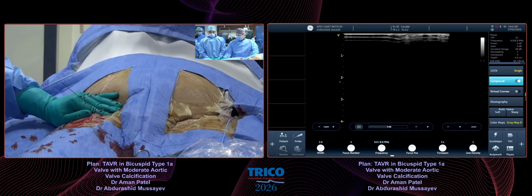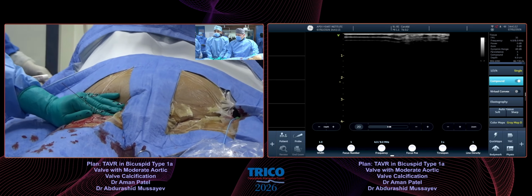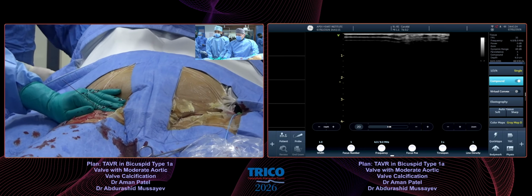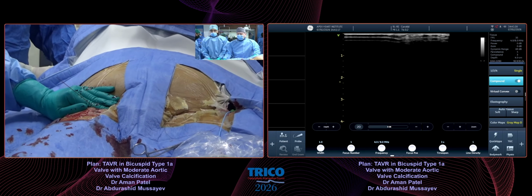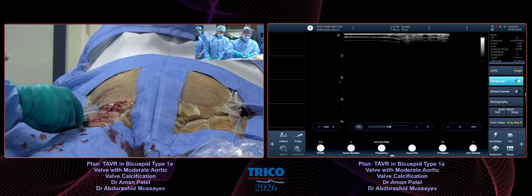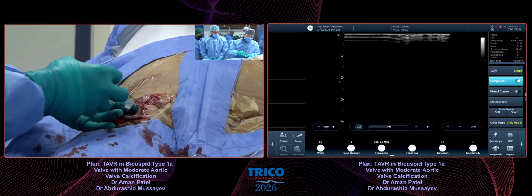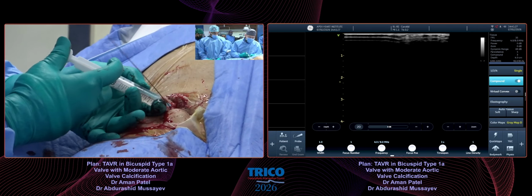Okay. When would you give how much heparin? At the time of puncture and then insertion of sheath? When do you choose? After the puncture. Okay, even before insertion of the sheath? Yes. Full dose? Yes, full dose. Thank you. It's interesting how differences in different sites.